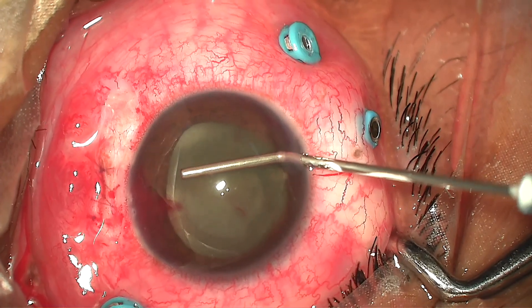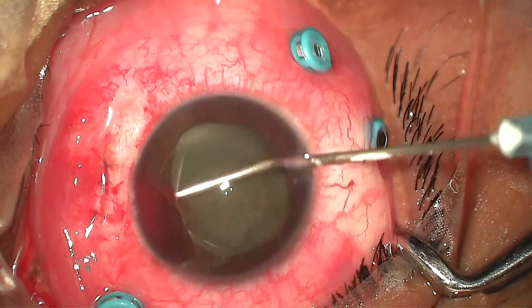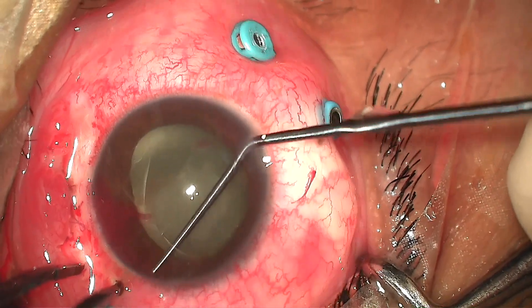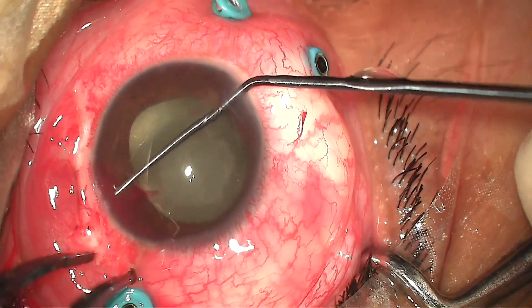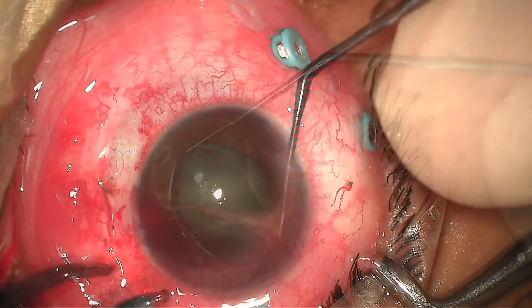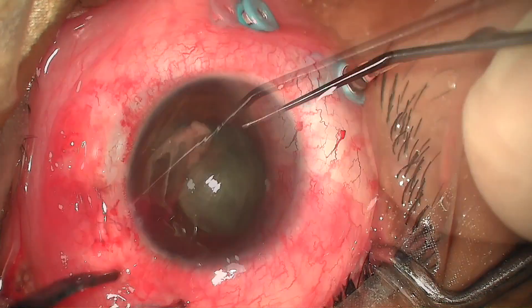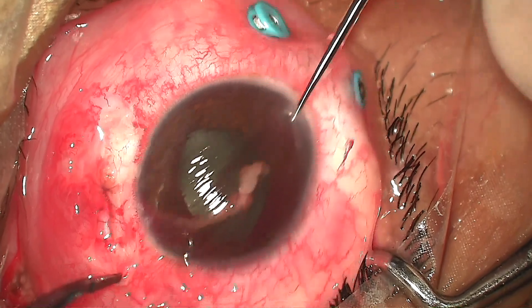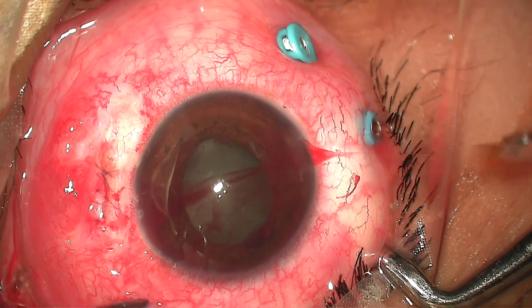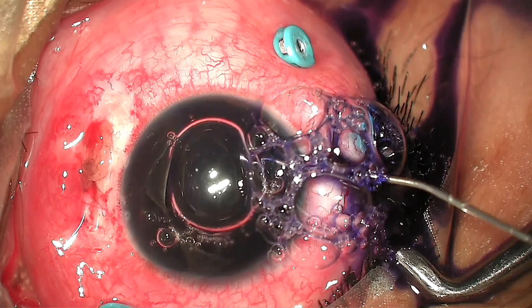Proceeding to cataract extraction, the anterior chamber was formed with viscoelastics. With the help of a lens dialer, the pupillary membrane was separated and gently pulled out in a single maneuver with McPherson forceps. Anterior capsule was stained with trypan blue.